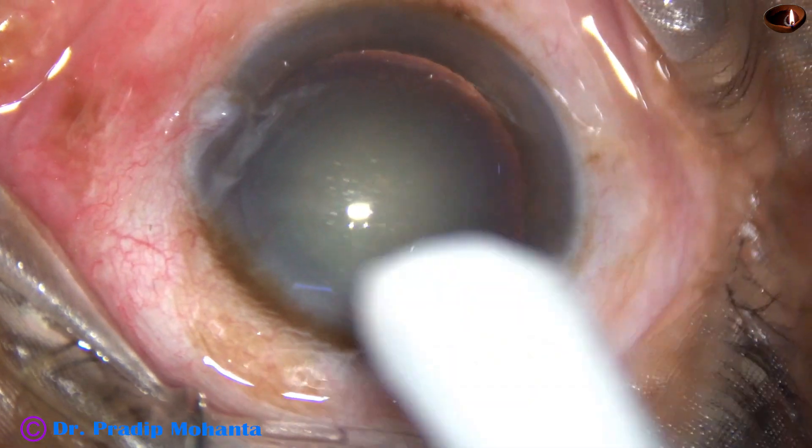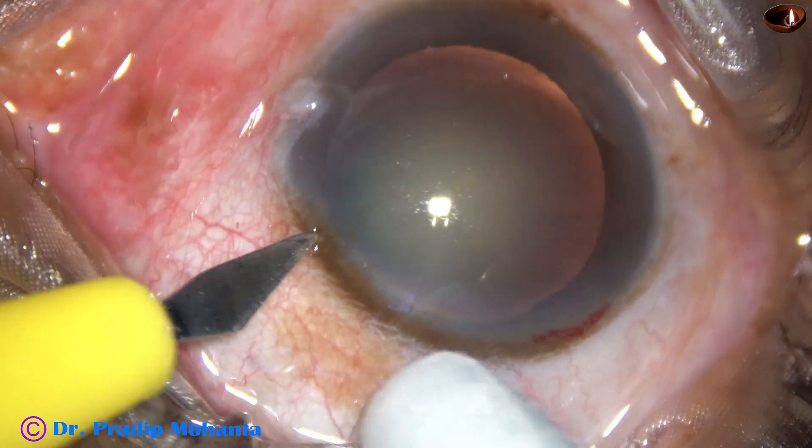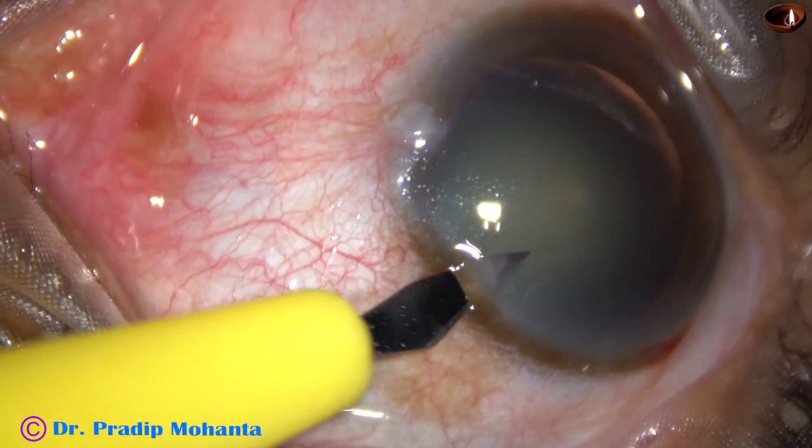By this time, the main incision has been made. And now, this is a side port on the left side of the main incision.